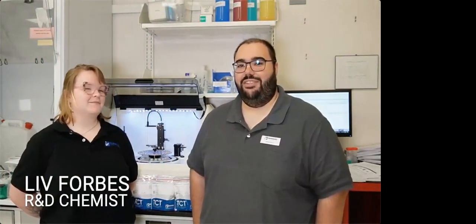All right. Well, thank you all for joining us in the lab. Today, we're going to talk a little bit more about discrete analyzer reagents. I want to introduce everyone to Liv Forbes. She is our R&D chemist, and she is the main person working on the discrete analyzer project at Inorganic Ventures. This is a pretty exciting project that we're going to talk a little bit more about the method chemistries. We're going to do some data workup. Liv is going to show you the process of actually setting up a run.